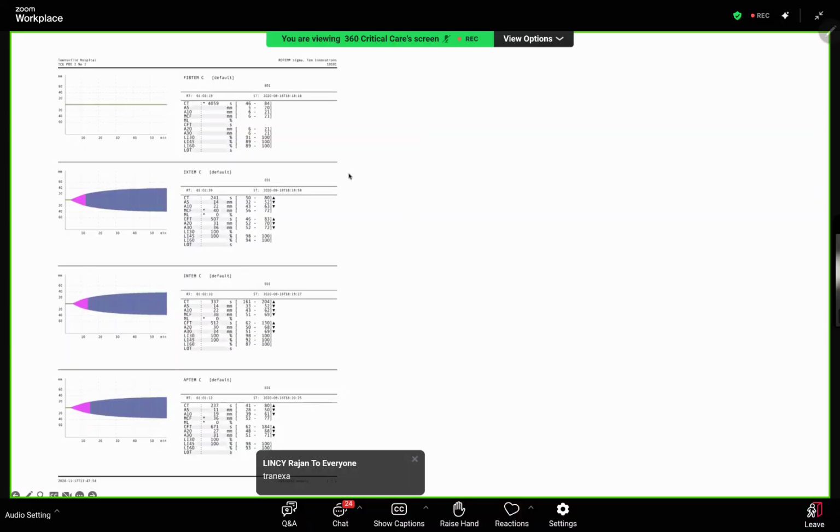I'm showing a lot of fibrinogen deficiency because it is very common, okay? So the way you can find a fibrinogen deficiency: one, A5 will be totally gone. There is no A5. The other one will be a high clotting time, and this can also be present if there is hyperfibrinolysis. So there is no fibrinogen and the clotting time is very deranged, and you will get a maximal lysis of more than 5% here. But this one doesn't have an ML of 5% or more. So this is probably only fibrinogen deficiency.